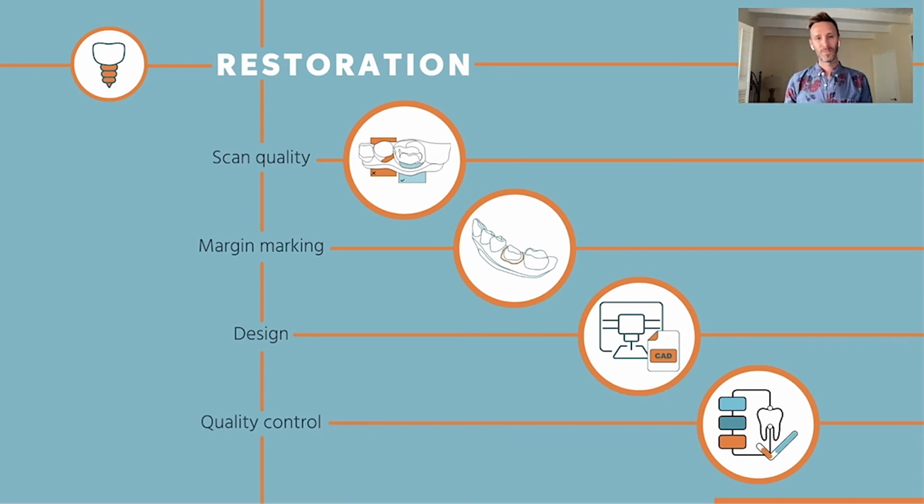From a design standpoint, many of you know that design in CAD software has been using AI for a while. They're taking into account what the other teeth look like. You can see this in companies like CEREC or 3Shape. They're designing using artificial intelligence.